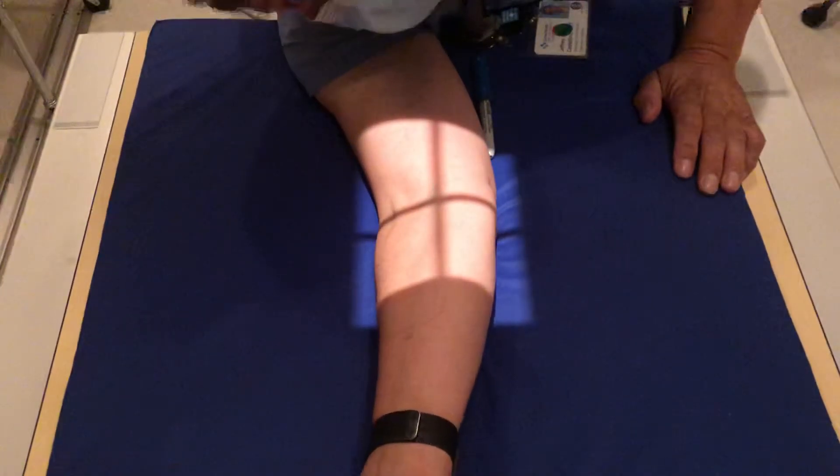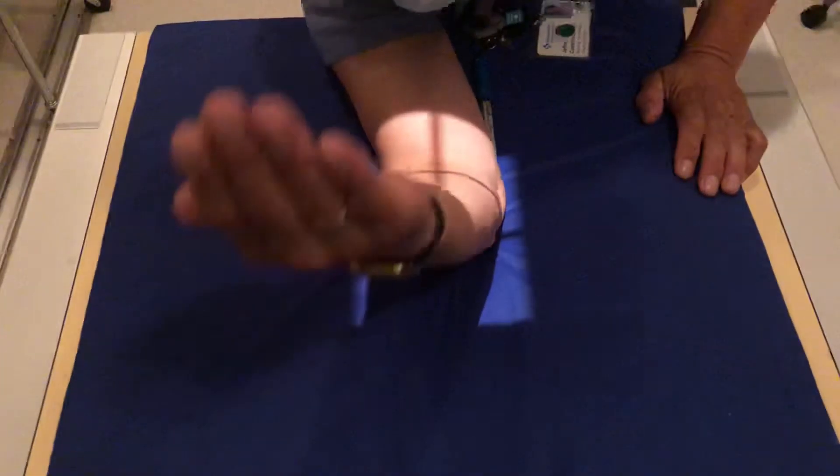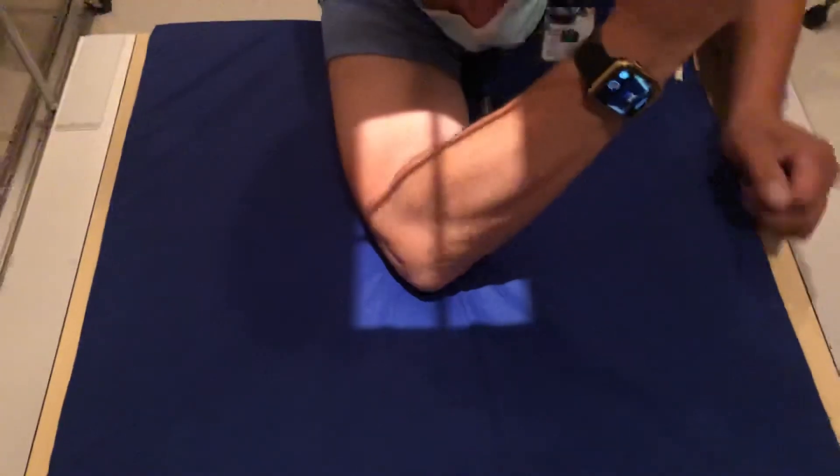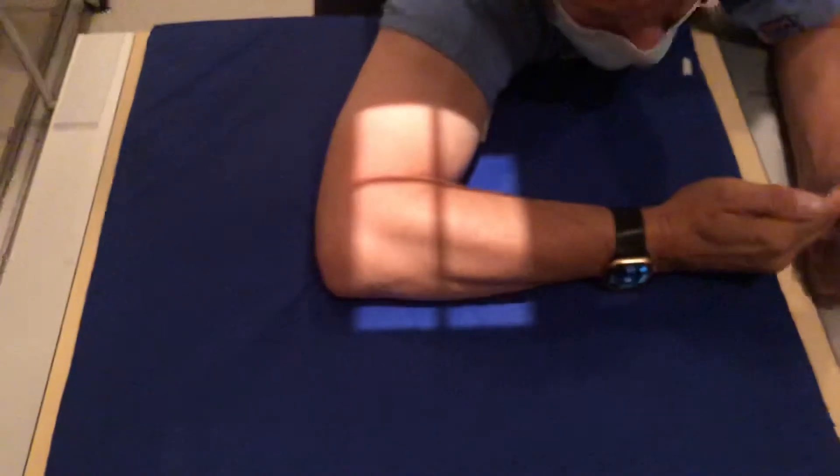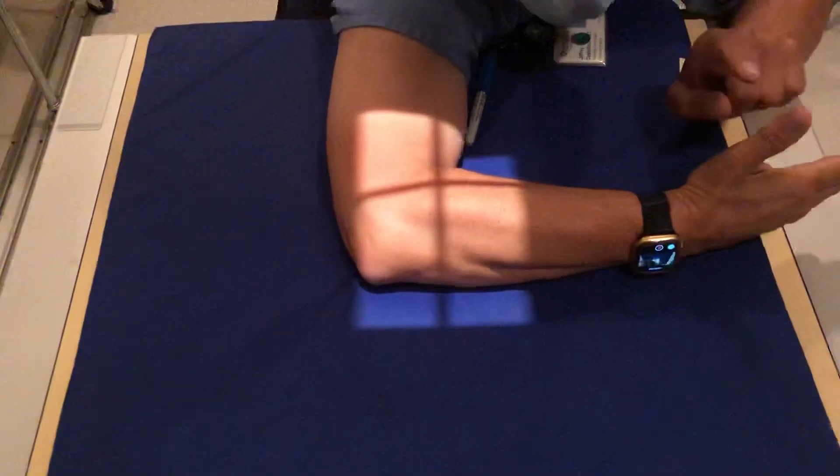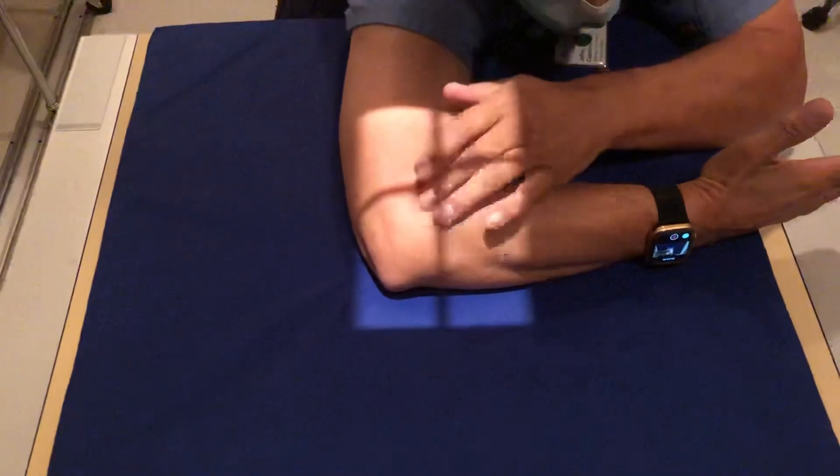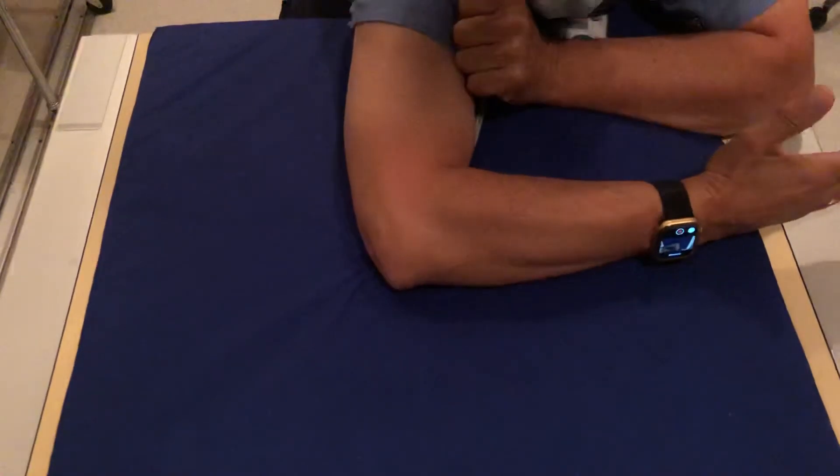The last view is you're going to make a 90-degree angle with your elbow, and then bring it down this way. Again, keeping the wrist, elbow, and shoulder in the same plane if you can.